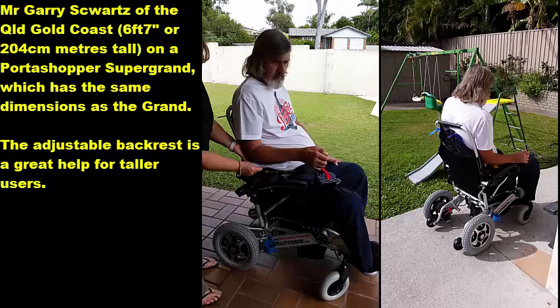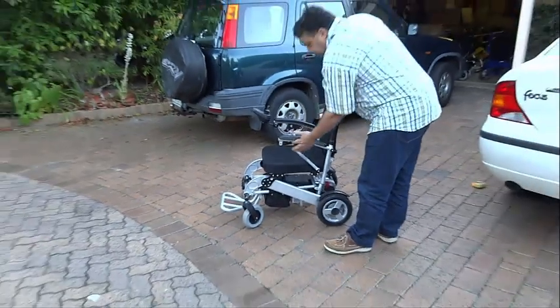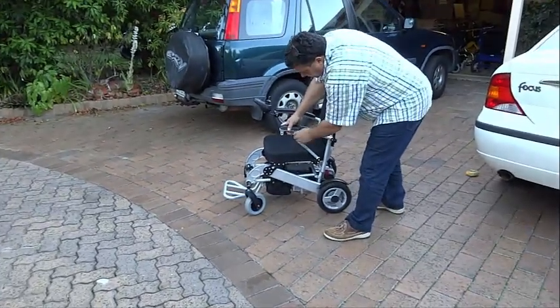We have clients up to 6'7" or 204cm who find this arrangement comfortable enough for the whole day. Please note that you have to select the option of having the Big Easy Kit factory fitted; the frame weighs 16.7kg once the motors — which weigh 3.5kg each — have been detached. The entire chair weighs 24.5kg.